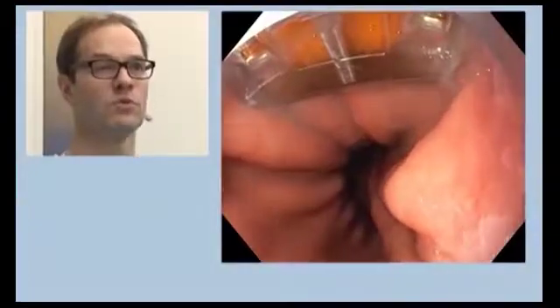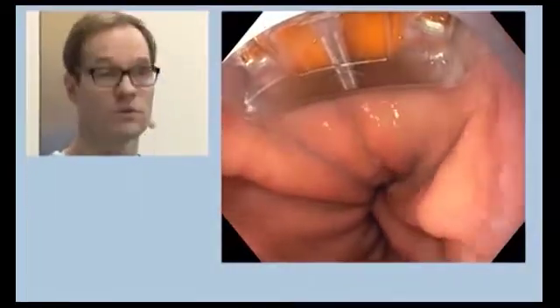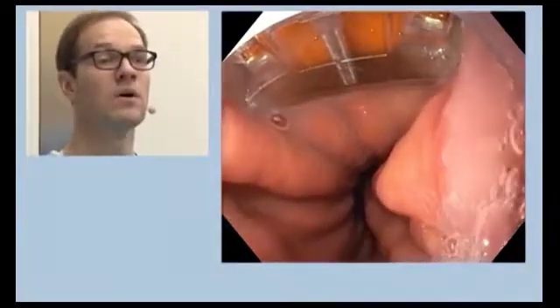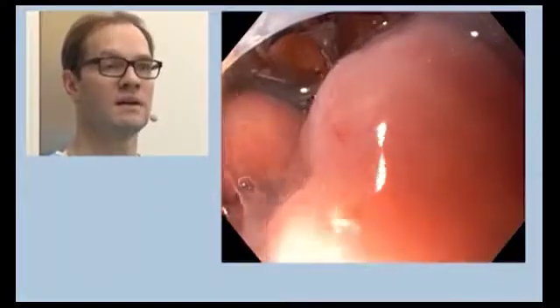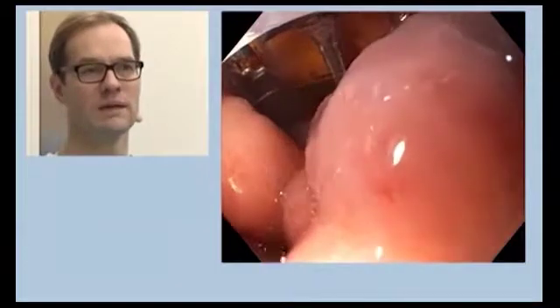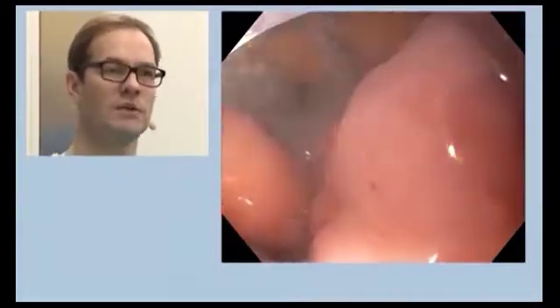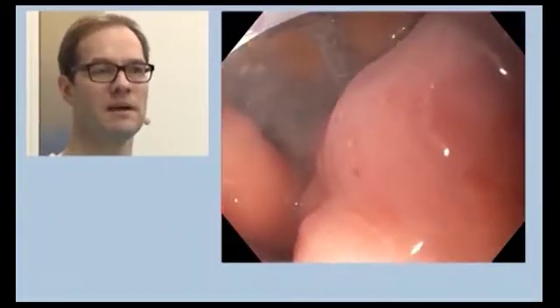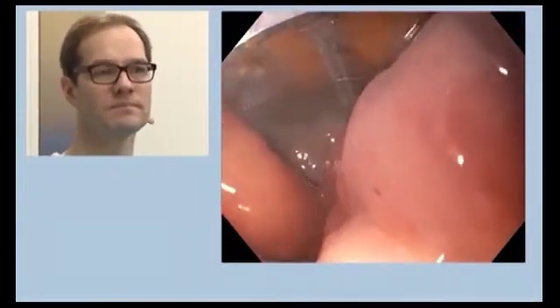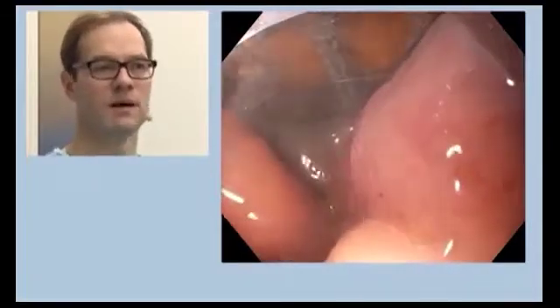Now this is the easy position that I start from at the 12 o'clock position at the top. I apply the catheter and with the large wheel press it against the wall a bit and suction the air out, so that the mucosa is well attached. I have my foot switch that I use to do the first ablation, and as soon as I get the signal I do a second ablation here.